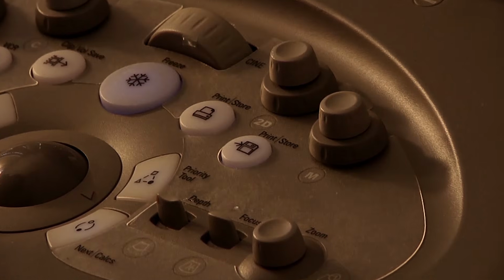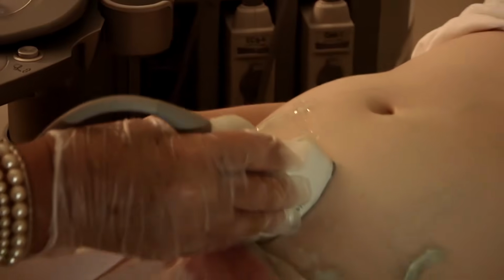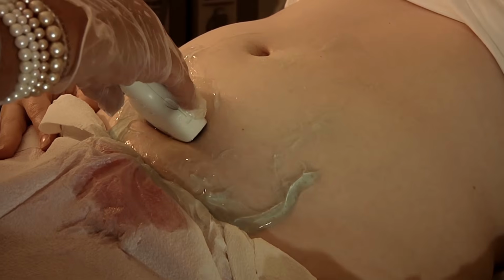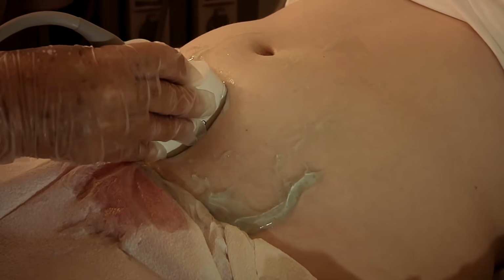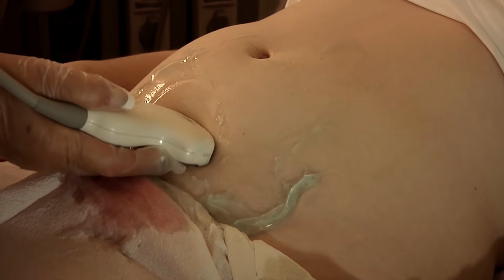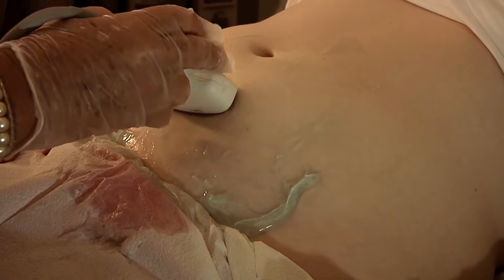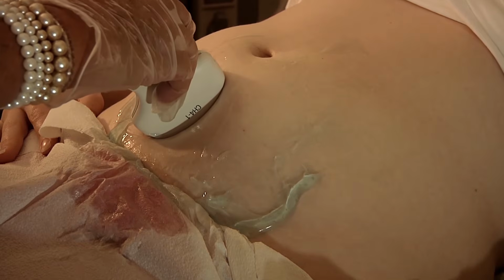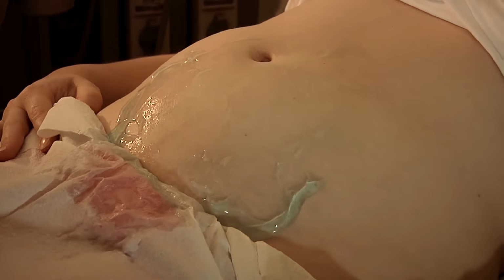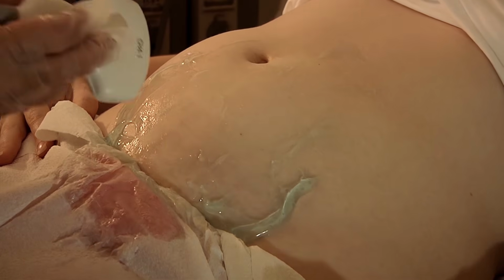So when you turn, you got to make sure, okay, when we're sagittal, the pointer's up here, you can only turn counterclockwise and then you can go back clockwise to 1 o'clock, but you can't go past 1 o'clock because otherwise you're scanning backwards. Does that make sense? And then if you bring your knob past 9 o'clock to 8 o'clock, you're scanning backwards. So the baby will look upside down, and you'll be thinking the baby's in breech, but it's in vertex. So that, does that make sense?